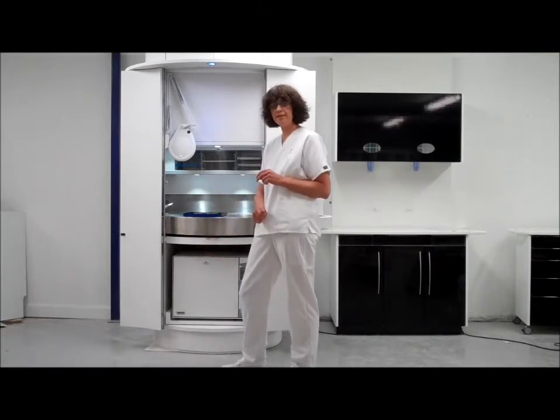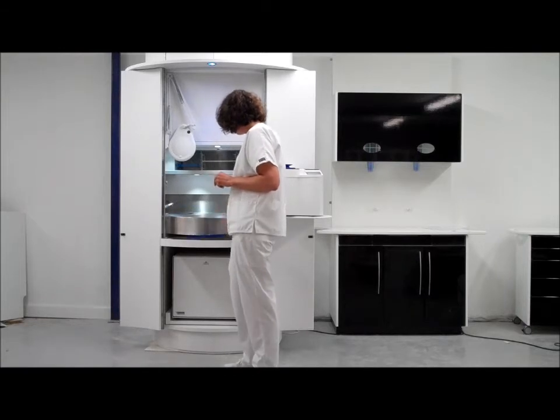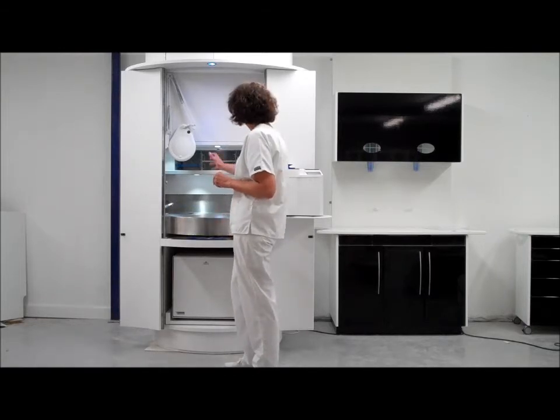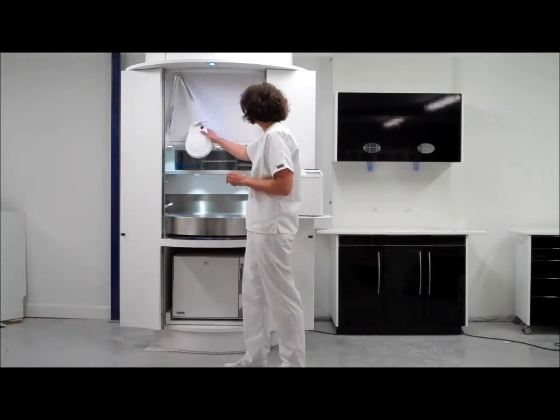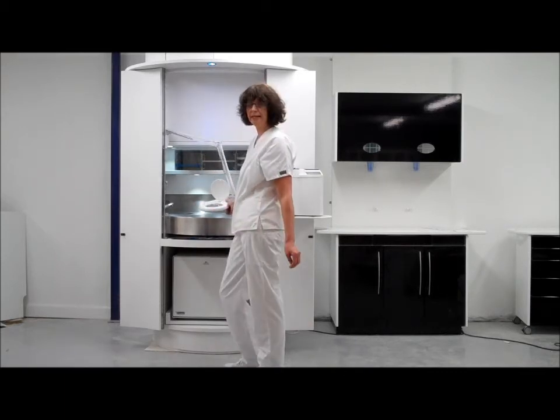Once the instruments have come out of the washer, there is a pull-out drawer which enables you to set down your instruments, and an examination light which enables you to check that the instruments are free from any debris.